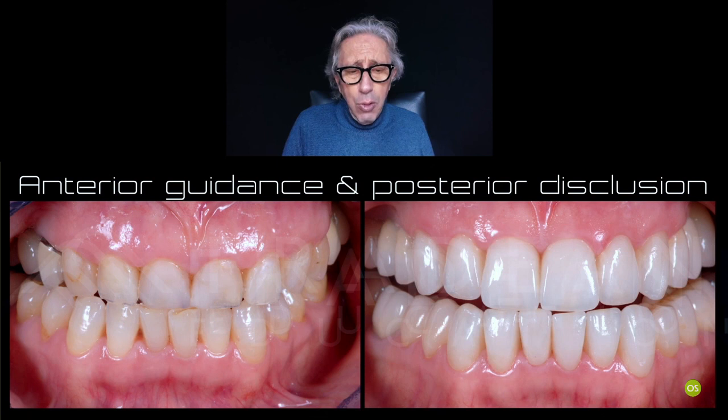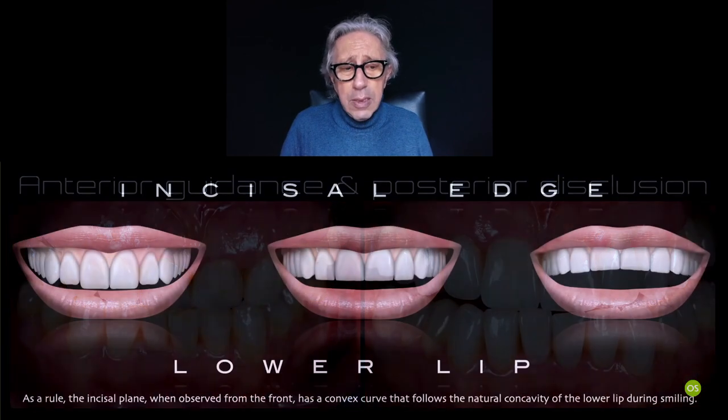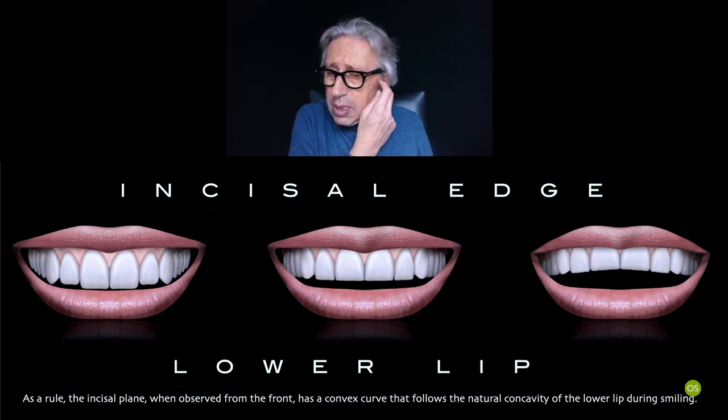And that also helps you obtain some functional optimization, remembering that we normally need to achieve this kind of anterior guidance, cuspid and incisal guidance, with the anterior teeth in contact when they move frontally and laterally, and you avoid any kind of interference in the back area when you move, as is shown in this picture, where it doesn't touch any posterior teeth.